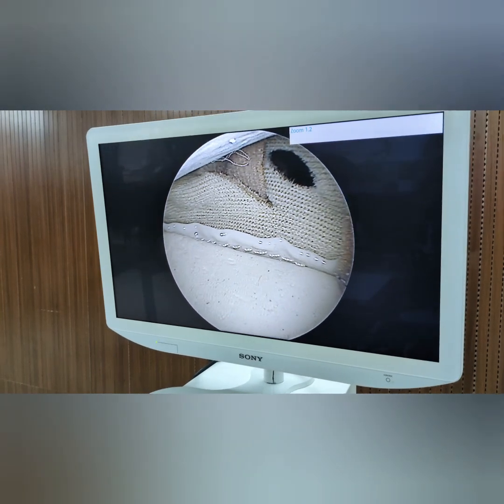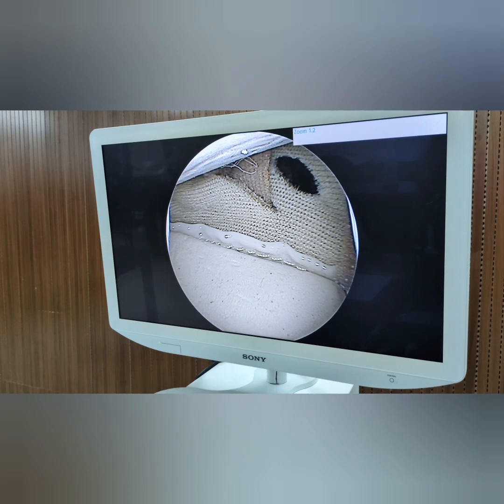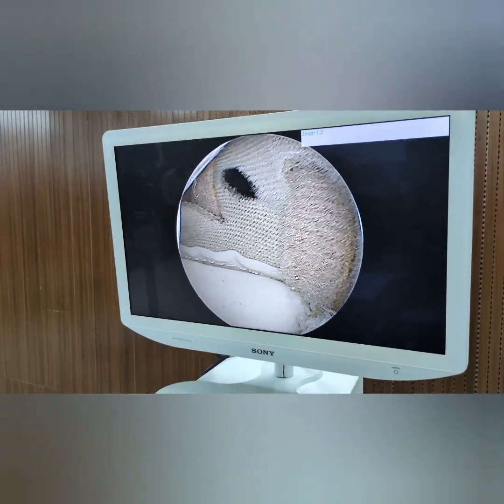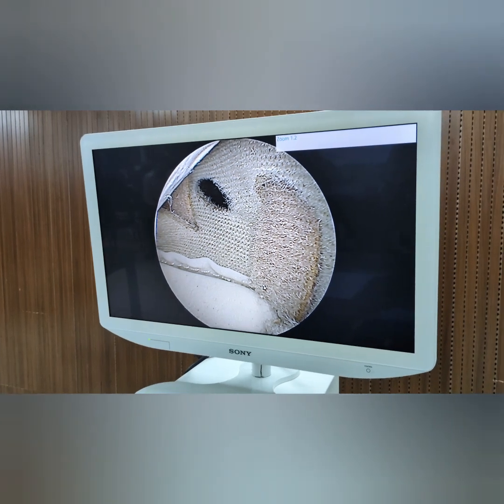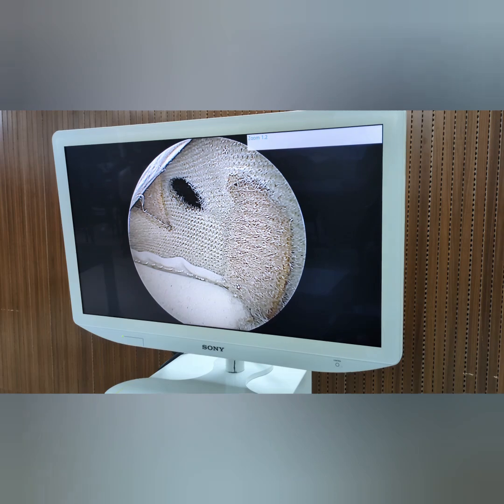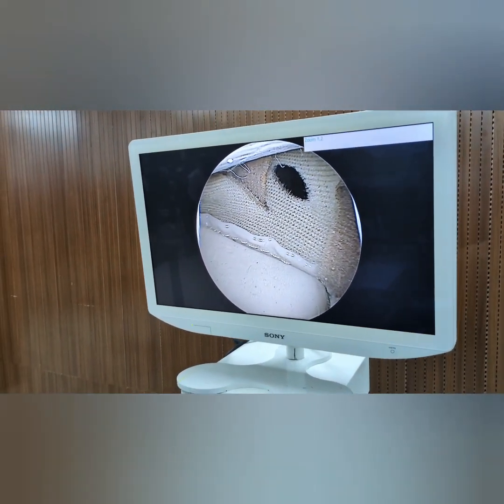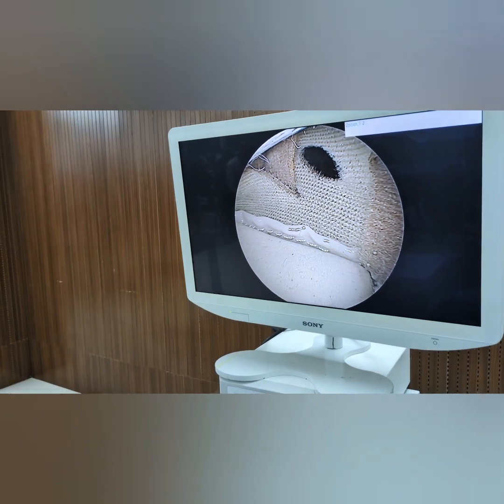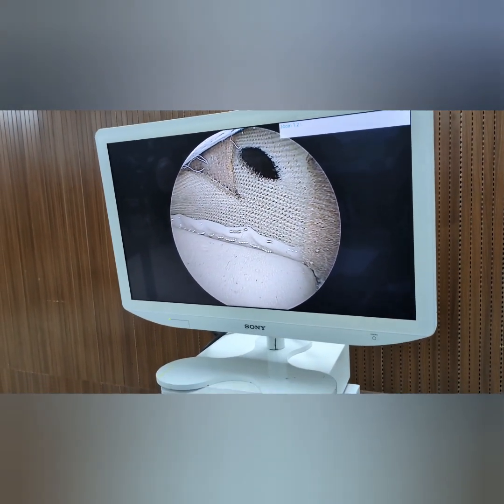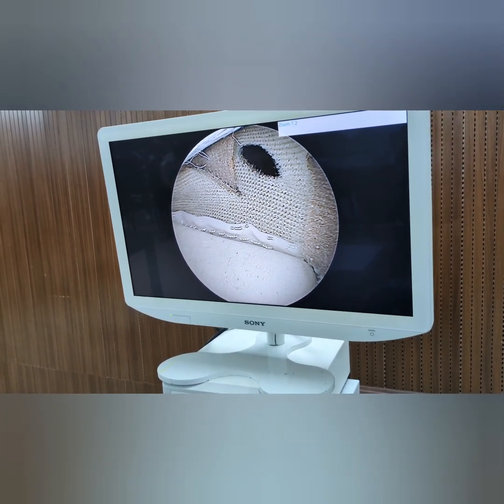And you can see this, the dark brown structure, which is subscapularis, which is on the anterior aspect. And can you see this, the other one, light brown structure? Now that is our biceps tendon. And can you see this, a fenestration or a hole? That area we can see our rotator interval. Rotator interval is the area between our supraspinatus and our subscapularis.